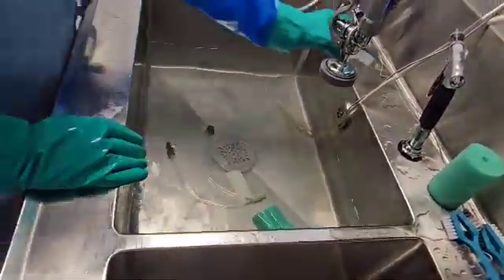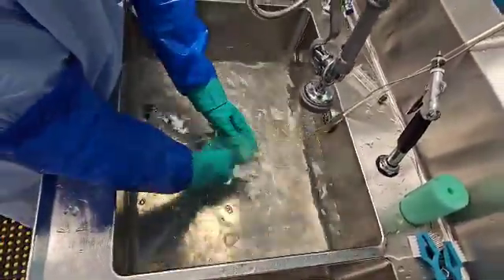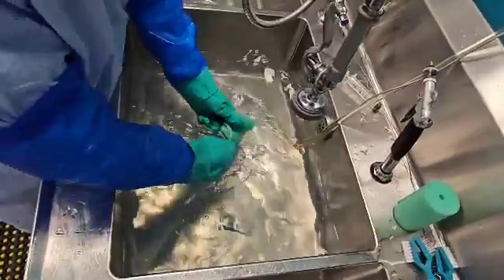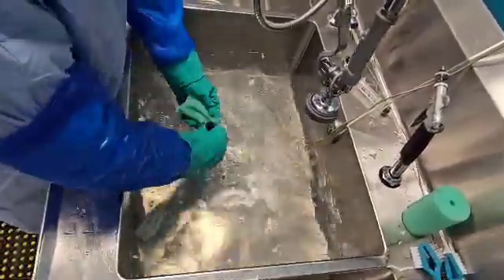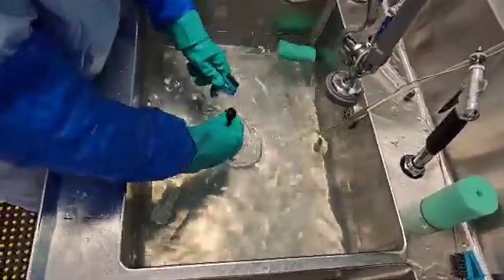After soaking for the specified time, go ahead and flush the tubing again with fresh detergent, and then apply some friction on the outside with your cleaning tool of choice. I'm using a sponge and a soft bristle brush here.